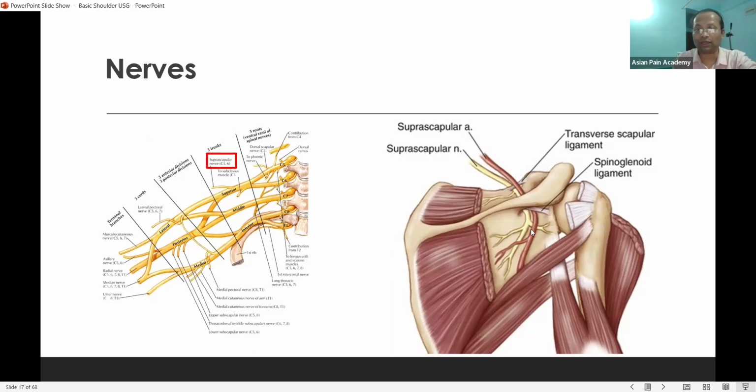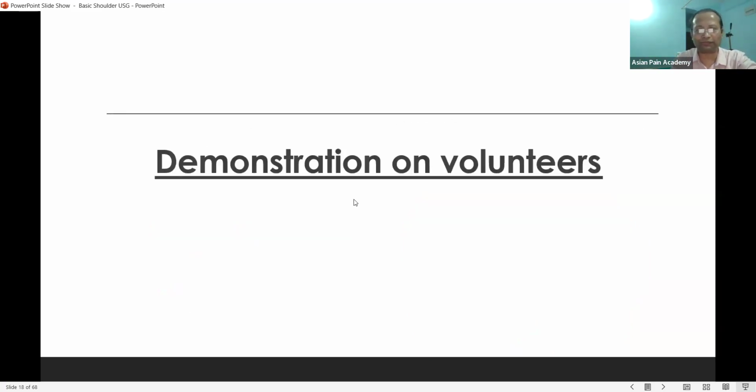But when you are actually targeting the spinoglenoid area, then it is only the articular nerves, and the motor part is already given off as motor branches to the muscles. So this is the sensory, only the sensory supply. Most of the time, for denervating purposes of the joint, we want this part only, the spinoglenoid area. And of course, if there is a problem in the supraspinatus fossa where there is a motor nerve, then we will not damage that. For other procedures, we can target there also.